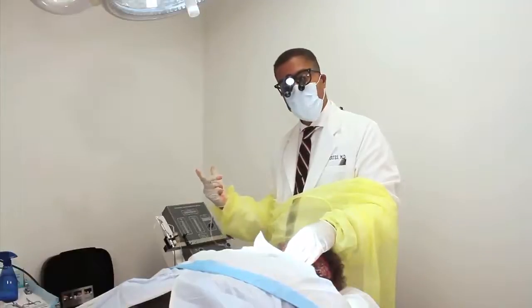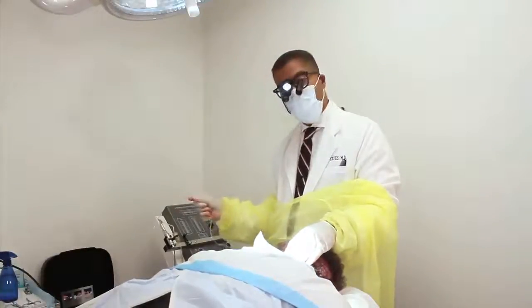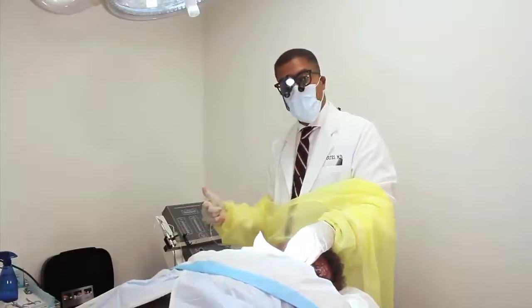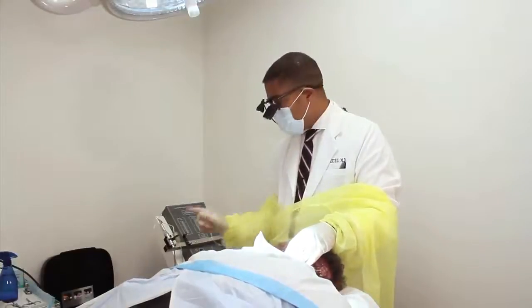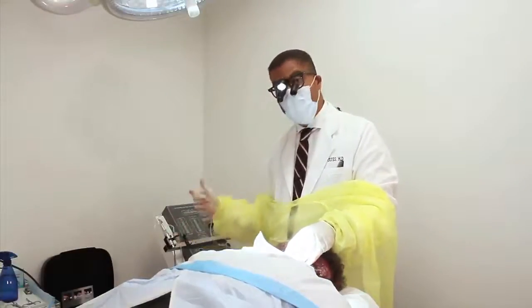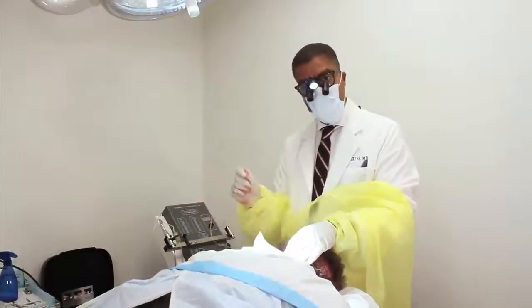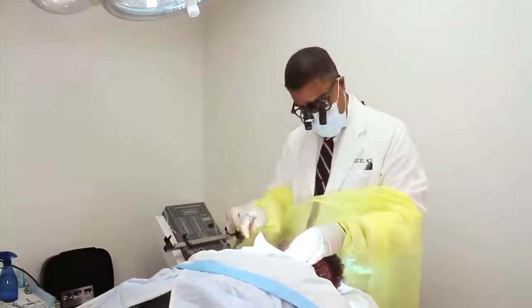It's just like if you play a sport — say tennis. You're a tennis player, but one guy plays with a Wilson and one guy plays with a Head racket. They're just two different instruments. This is a motorized punch, but it's not automated — it's not like the ARTAS where it's a machine doing the work. You're still using this punch to actually punch the grafts.